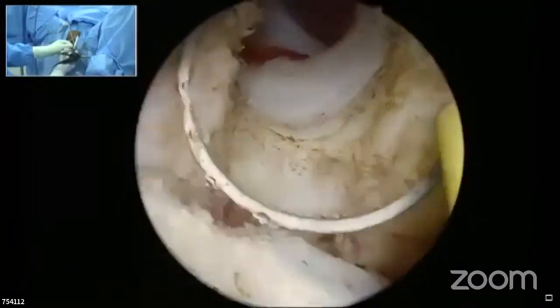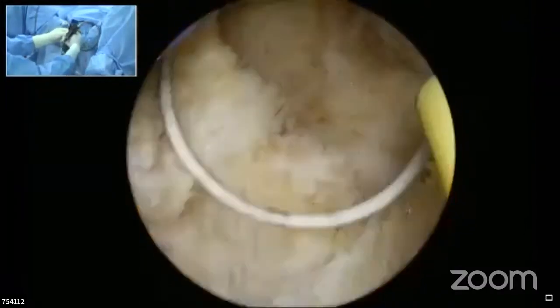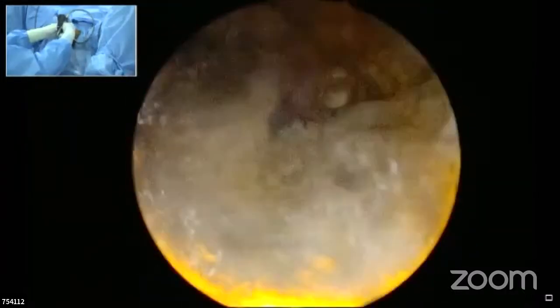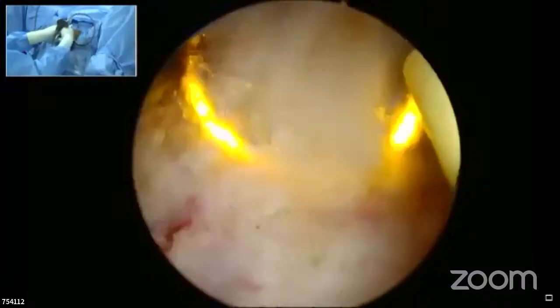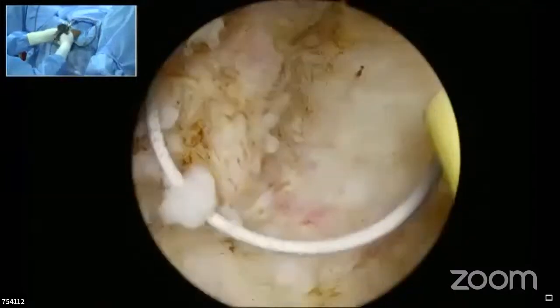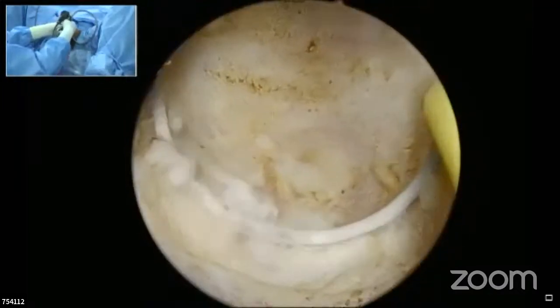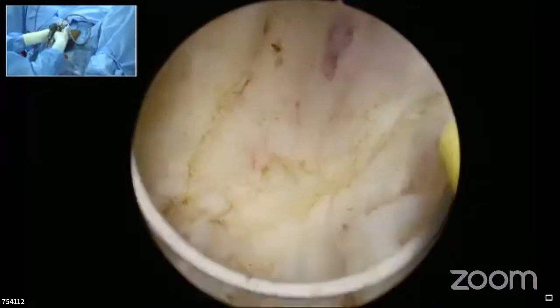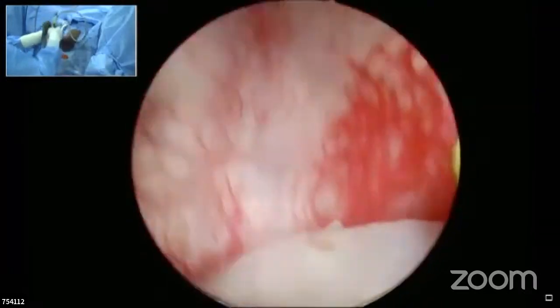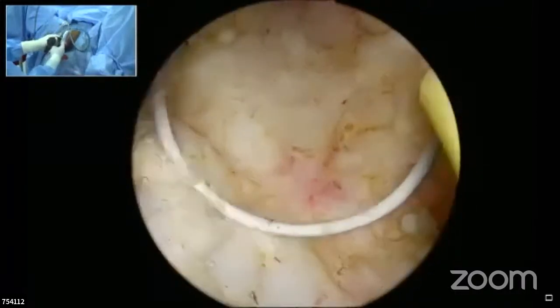There's a question from somebody that he's got obturator jerk during a prostate resection. Yes, it can happen. Very, very common. Muscular fibers beyond the capsule tend to contract. You can develop it if it is a very large lateral lobe with the gland extending laterally, and if you are resecting with a completely distended fossa. In this perforation, exactly that happened: there was a contraction which brought the capsule closer.